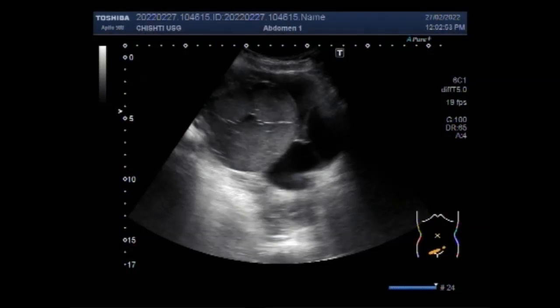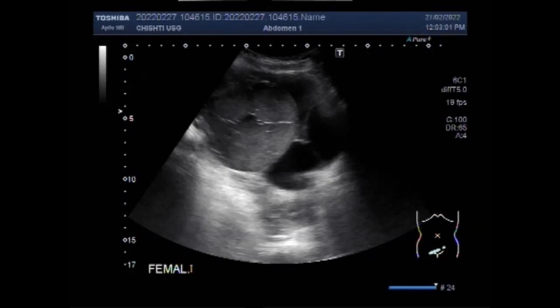Dear viewers, I hope you are all fine. This ultrasound video shows a case of complex ovarian mass with a patient aged about 84 years.